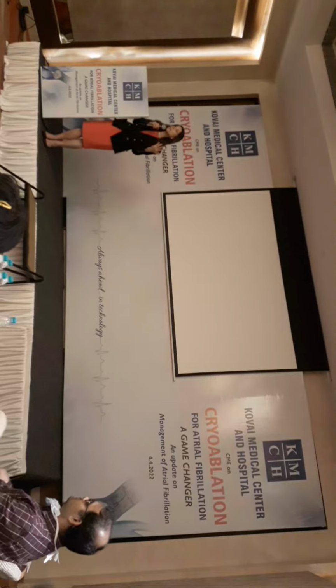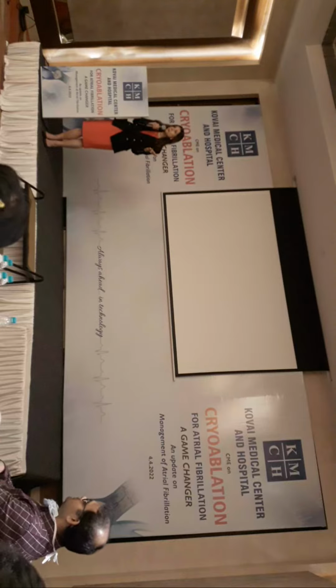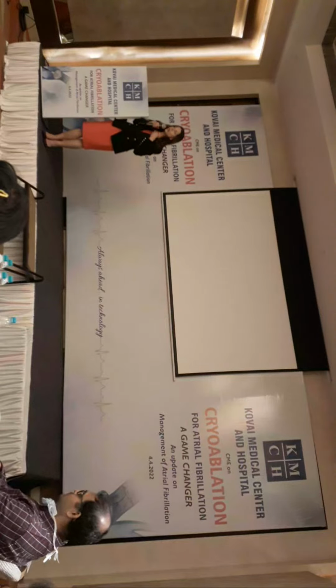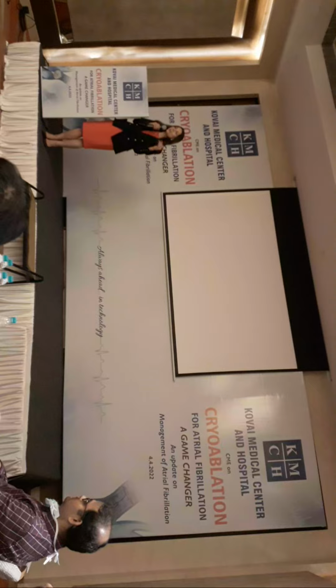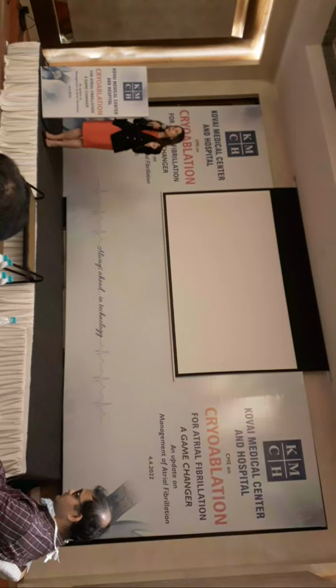And then today, I will say, I was really impressed how comfortable the patients were. I think he did a great job preparing the patients. Although I used to deliver my own conscious sedation during ablations, we had some younger partners join our practice a few years ago who would only do their PVIs under general anesthesia. So like 98% of all of our PVIs were done with general anesthesia, which in some ways actually increases the risk because they can have risk from receiving general anesthesia. I just can't wait to go home and tell my partners that people are doing it here with conscious sedation. The patients did just great.